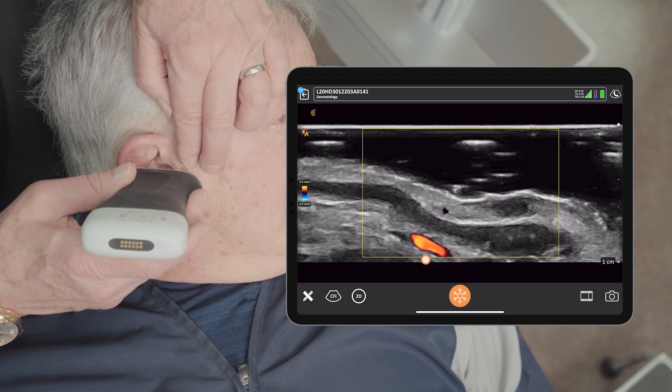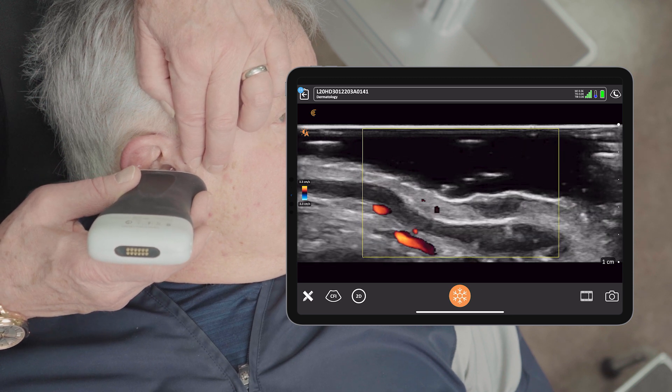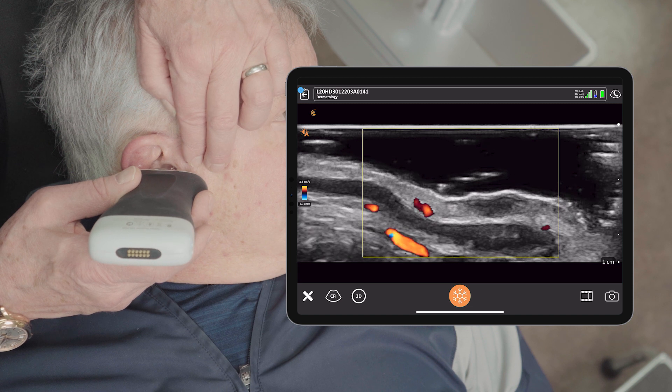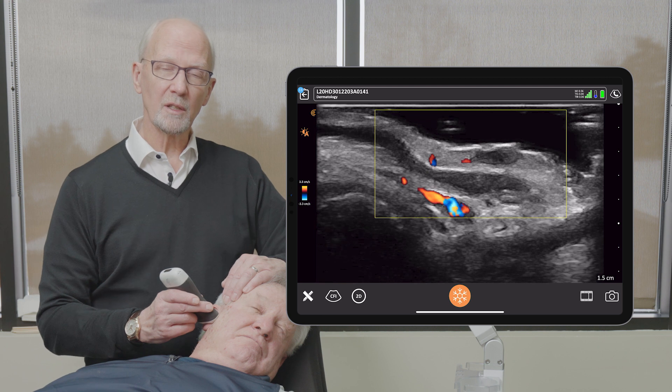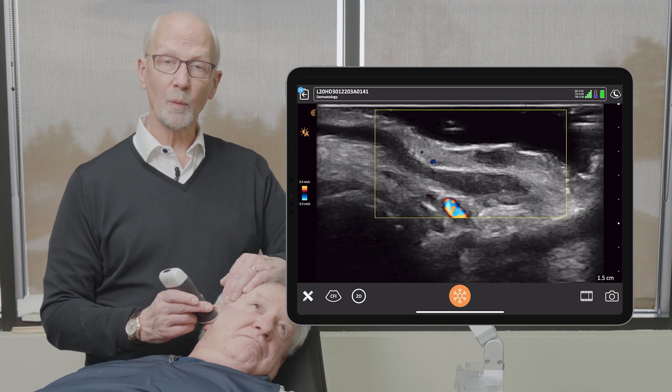...most of the vascularity is from the posterior aspect of the ear. We've passed through the cartilage. We do have a little bit of vascularity medially, but not as much associated just with the lesion.